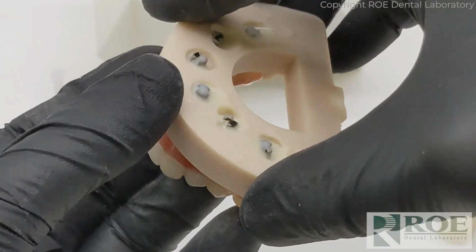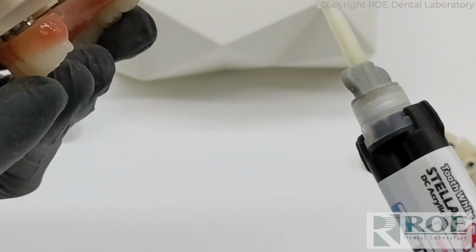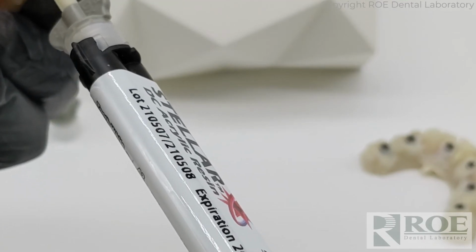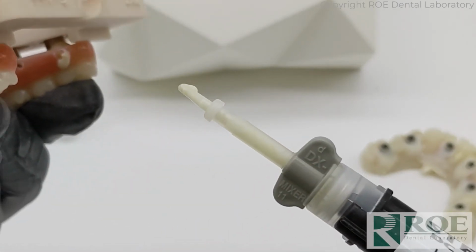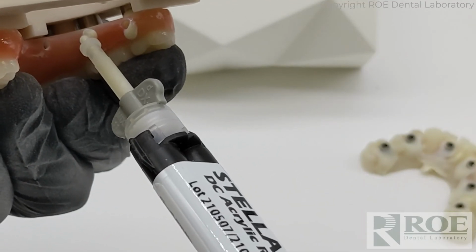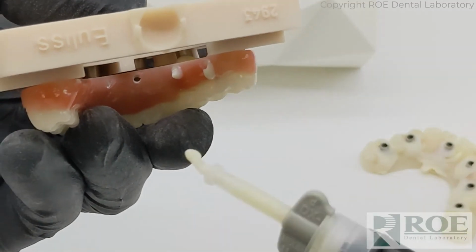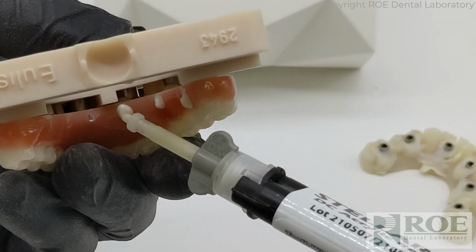Okay, so we're going to introduce the model. Then here's the trick that we've learned from doing a lot of these cases: keep the teeth down and then just introduce the material into the port until you can see it kind of bubble up back in the well. You see that? You can see the material filling the well, and it goes all the way up to the chrome, to the Smileloc coping. Inject until you can see it. So you can see a little bit of material in there. Might be hard to see, it's kind of back in the dark. But teeth down, backfill until you see the material. There it is, right there.